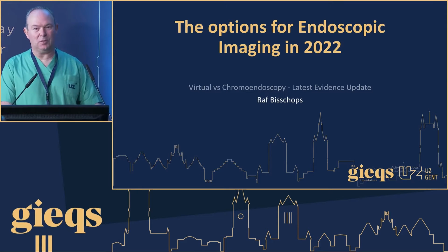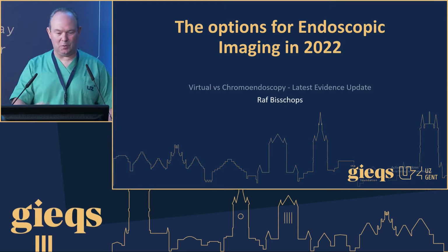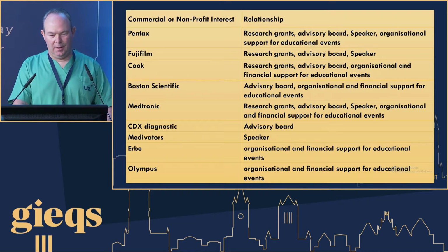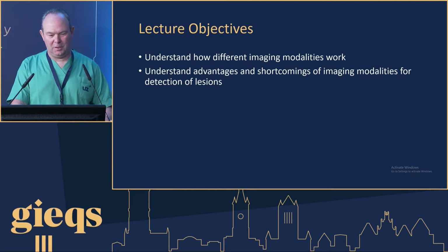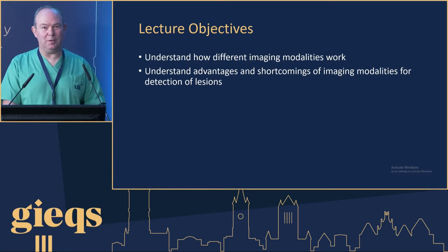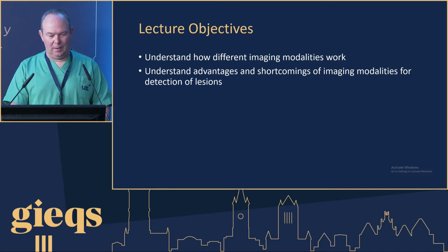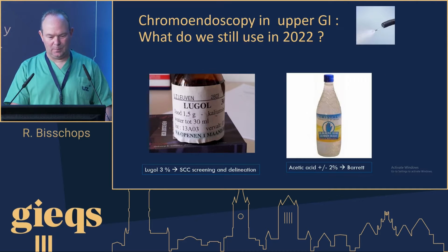Okay, so I will try to introduce the different modalities that we use in endoscopic imaging, focusing on the upper GI tract, obviously. So after this talk, you should be able to understand how these different imaging modalities work. It's going to be a little bit technical, and understand also the advantages and shortcomings of these techniques.